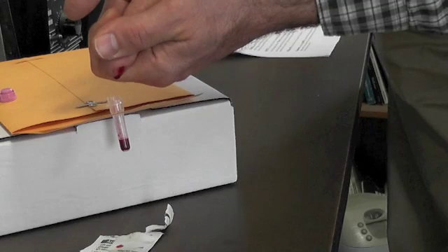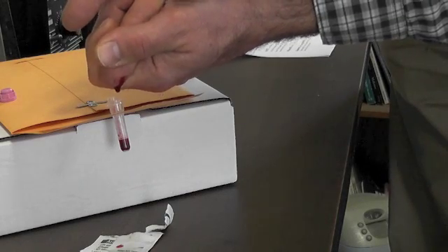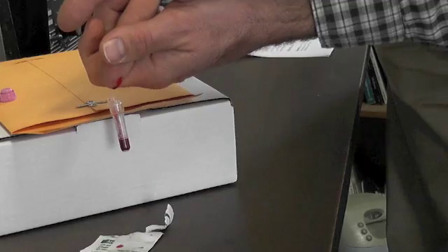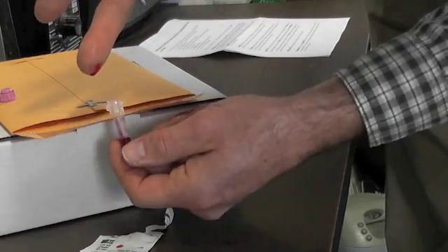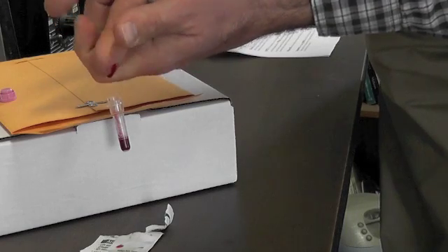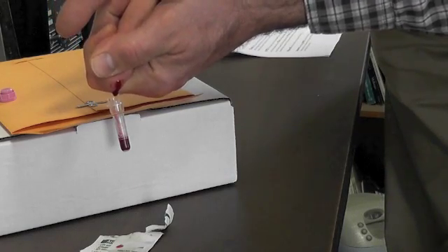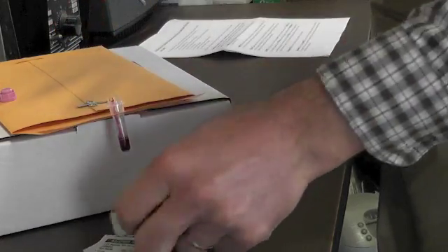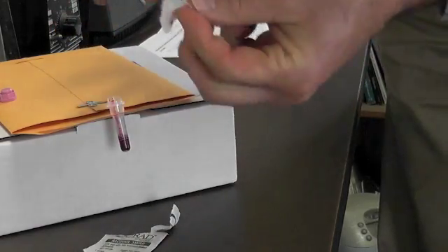It's working pretty well. I'm going to go ahead and get another drop and just let that hang there a little bit. It just falls in. I got plenty. Well, I feel generous today, so I'm going to give the lab one more drop. Just let that drop off.